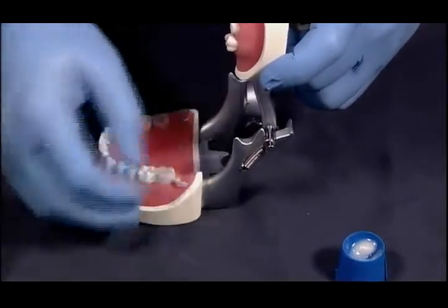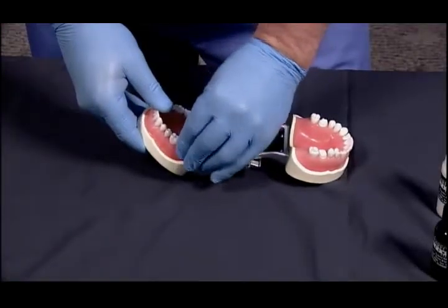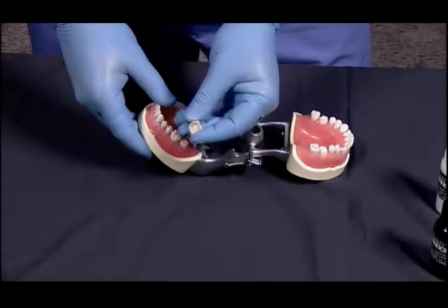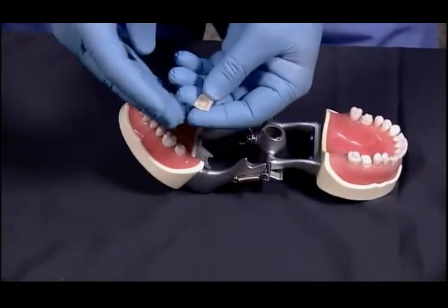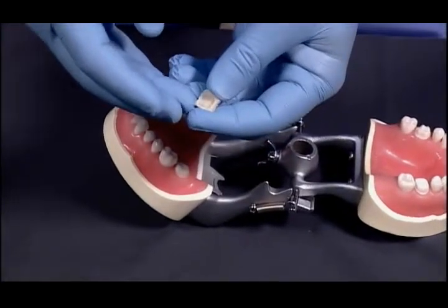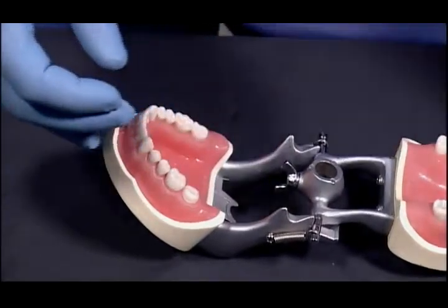And I'm going to let it sit and harden for a little while. I just removed a little excess material there. Once the lined temporary crown shell has set completely, we'll remove it from the tooth. We can see that we have very good adaptation, and we'll take this back to the lab and remove the excesses, get the contours trimmed back to the margins, and go to delivering the temporary restoration.